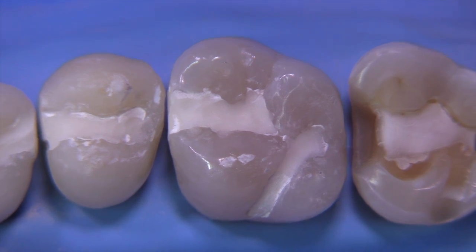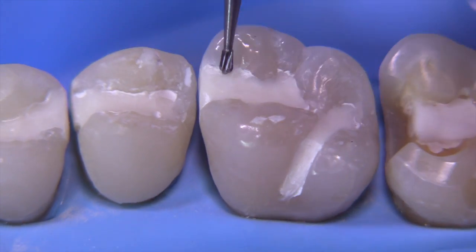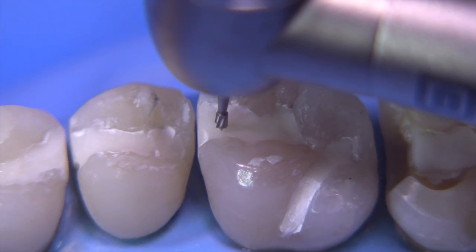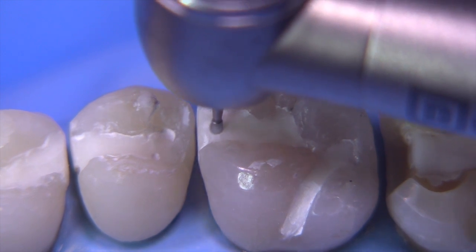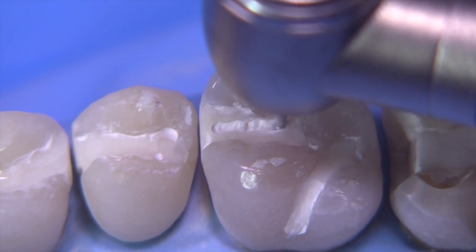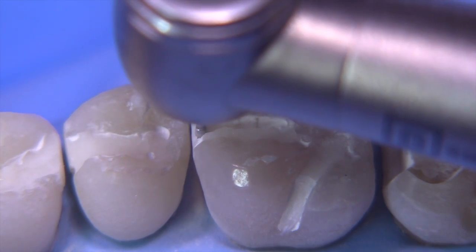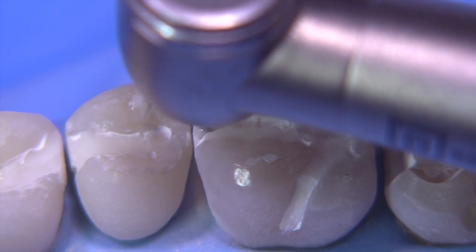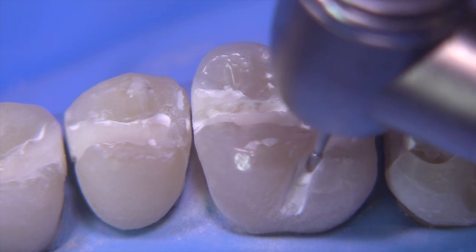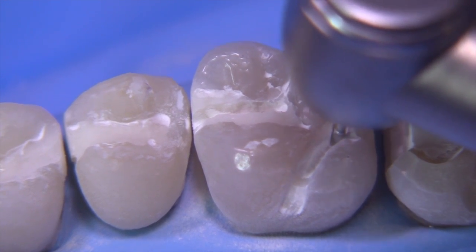We're going to start with the MO on number 14 in the usual manner, first by utilizing the 330 bur for our depth cut. It's important to note that the 330 bur is pear-shaped, so you will leave undercuts if you hit the walls too much. You want to try to keep this in the block-out material or in the center of the outline as best you can.